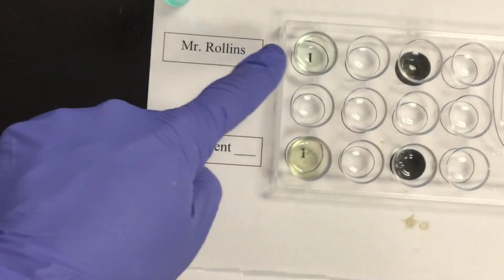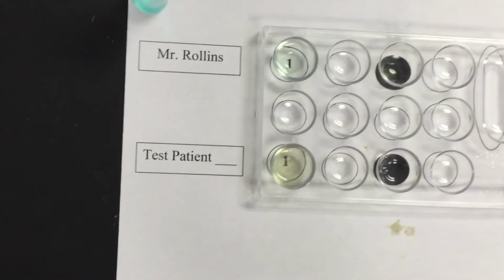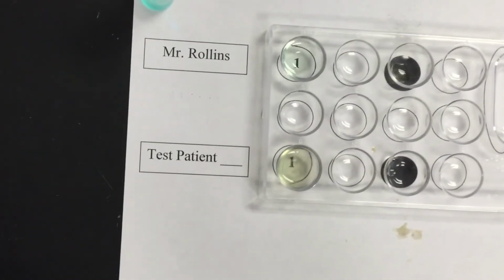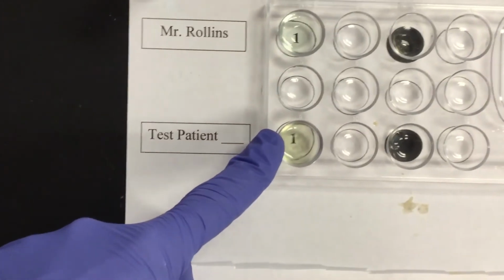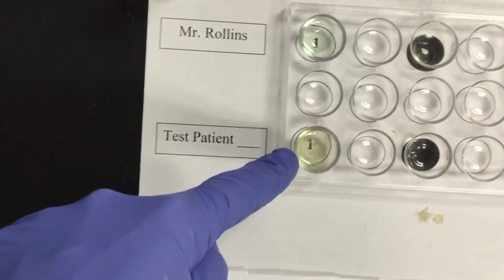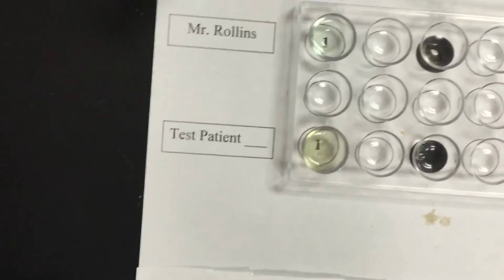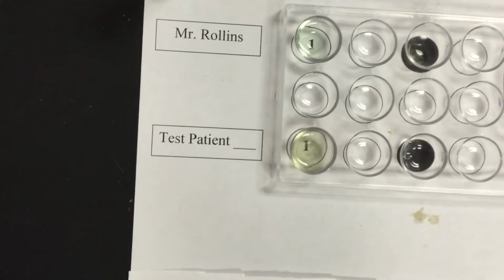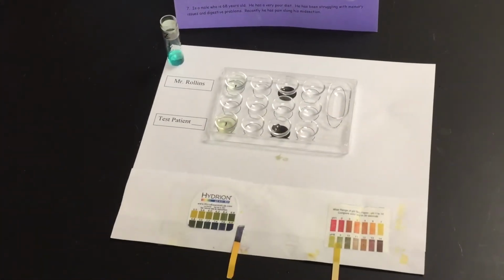So if we go back to proteins real quick, remember this test that we did here, we use biuret solution, which is kind of a lighter blue purplish color. So any color change from the normal urine is not a chemical reaction, it's just the mixture of the urine and the biuret solution together. So in order for that, after it sits 3 to 5 minutes, to have a chemical change, it needs to turn a pinkish color. So we have done color, clarity, pH, and proteins and chloride.